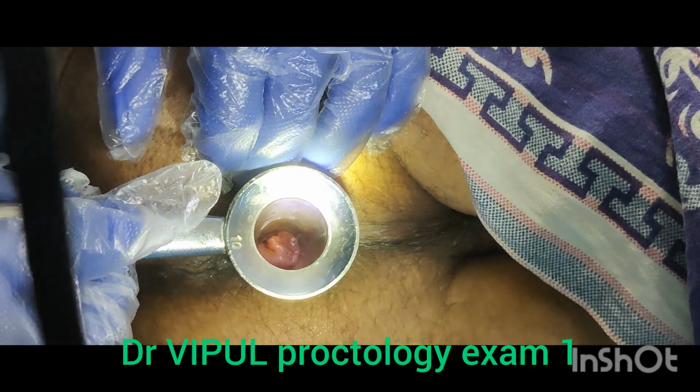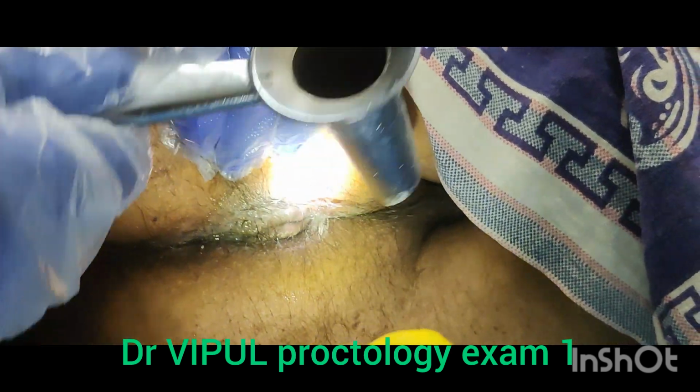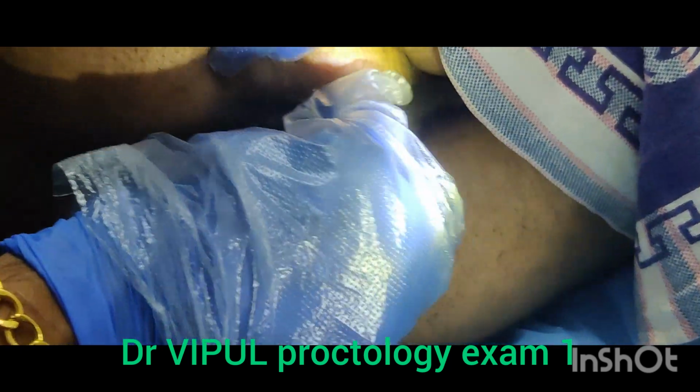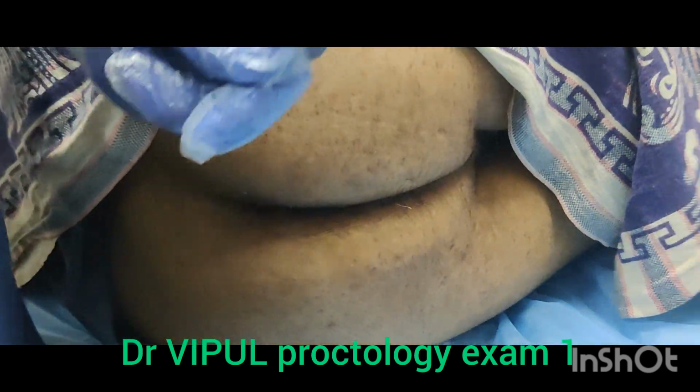For the examination, withdrawal is important. Anterior, posterior, left and right movement of the proctoscope is important. After this, we have to clean that part also. That gives the patient full satisfaction.